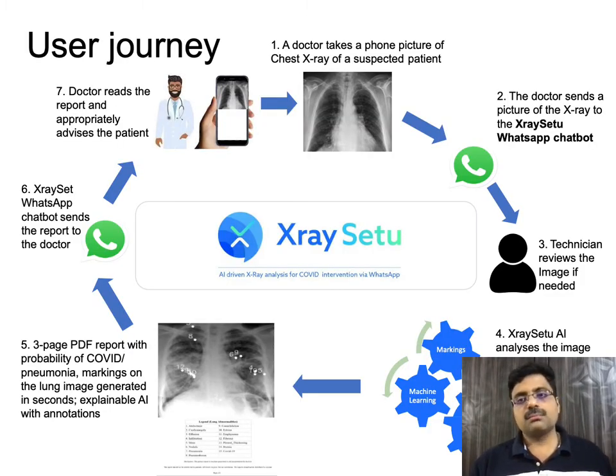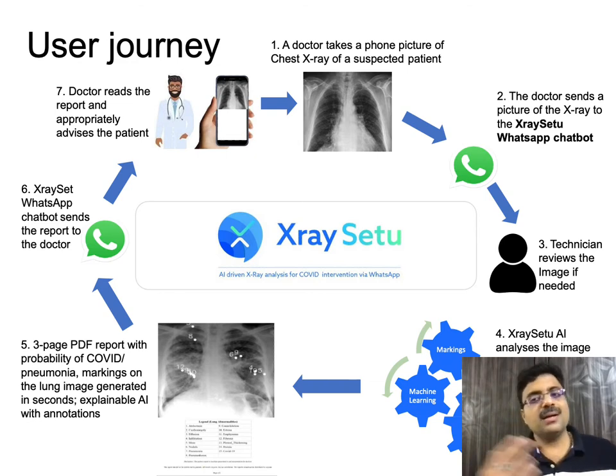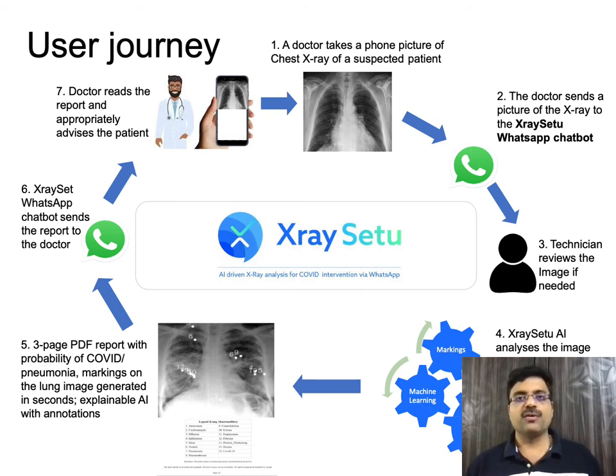So, X-ray Setu is actually meant to serve only doctors and X-ray technicians. The typical scenario would be a small medical center in a suburban or rural setup with a doctor and either a dedicated or a shared X-ray facility, which may even use an old analog X-ray machine. While the model can definitely work with digital X-ray images and DICOM images, realistically, the overwhelming proportion of images received was always going to be and expected to be low-quality mobile phone captures of developed analog X-ray films.